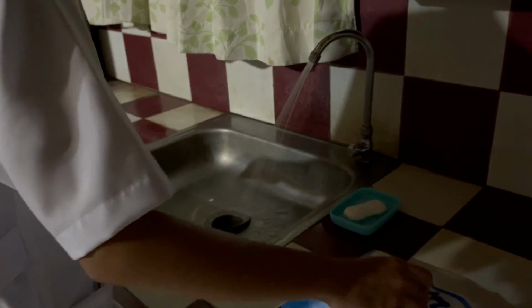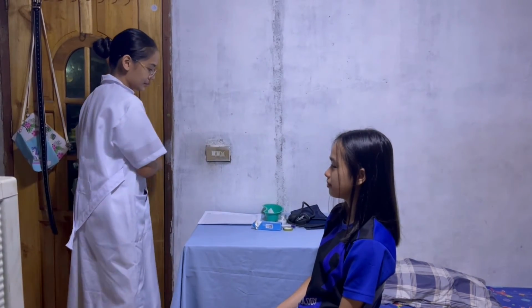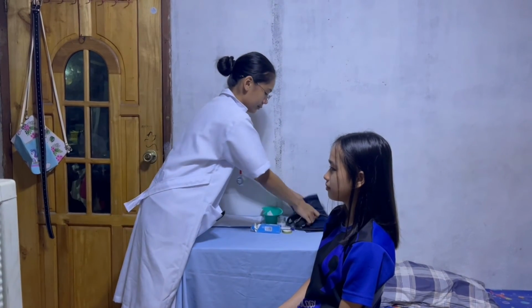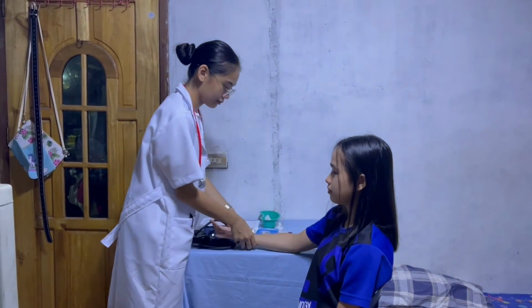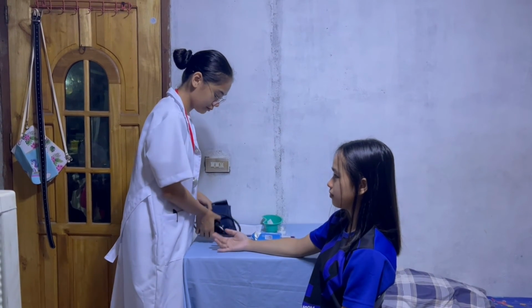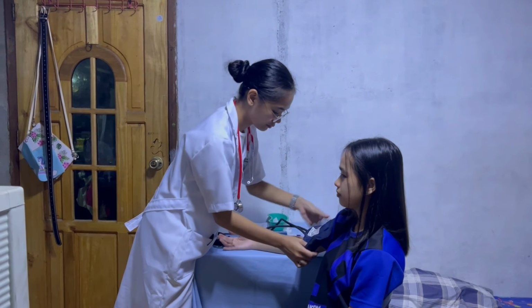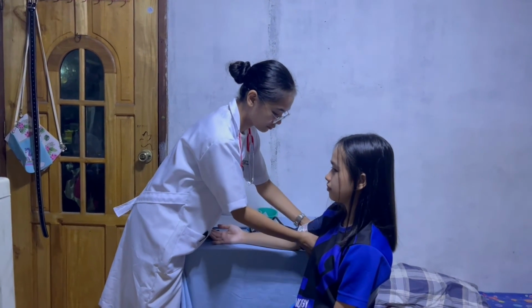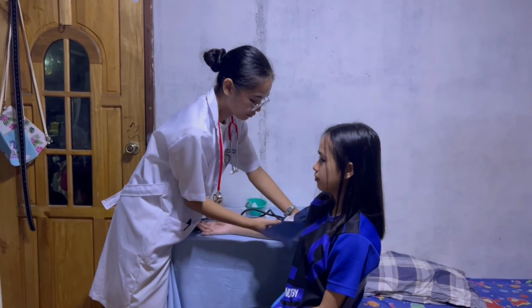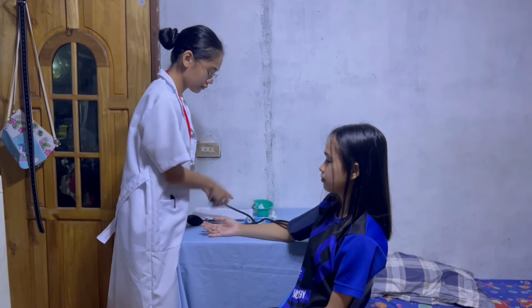Perform hand hygiene and observe appropriate infection prevention procedures. Provide for client privacy. The client is in a sitting position with both feet on the floor. The elbow is slightly flexed with the palm of the hand facing up and the arm supported at heart level. Expose the upper arm if the clothing is tight. Wrap the deflated cuff evenly around the upper arm and locate the brachial artery. If it's the client's initial examination, perform a preliminary palpatory determination of systolic pressure.